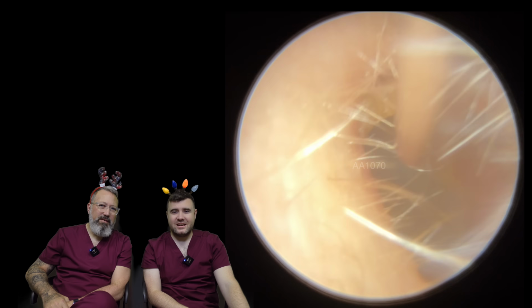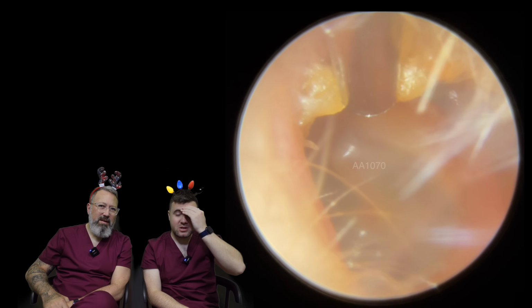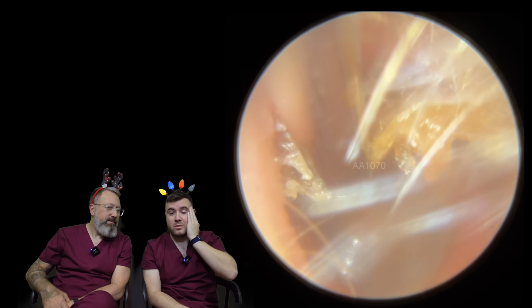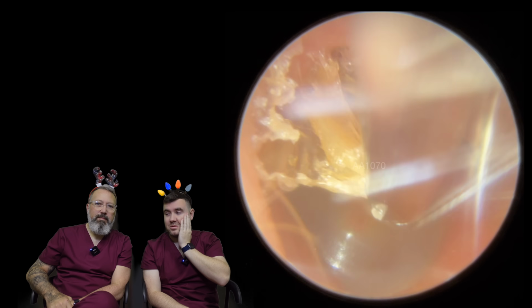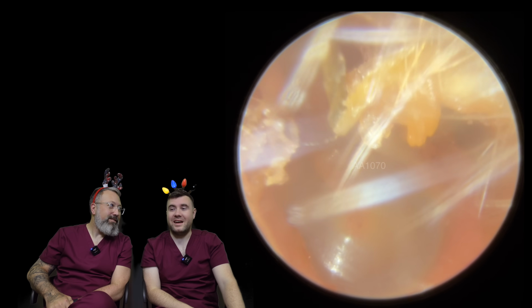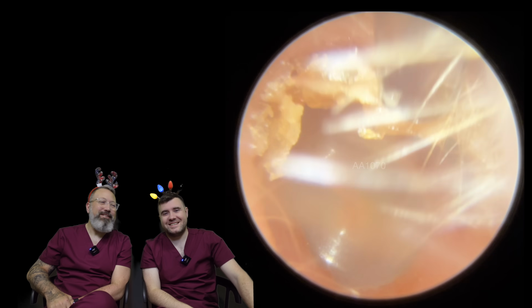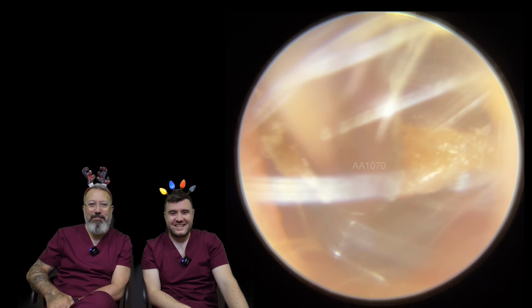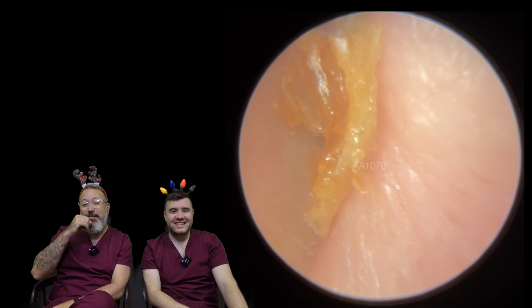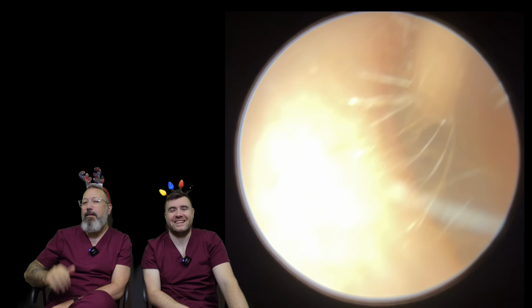Nice big chunky piece there as well that came away. I always need to remember to slow down when I'm coming out of the ear. It's a bit awkward when you've got a family member sitting on your shoulder and you pretend you're frozen. Like the Matrix kind of thing. That'll be handy if you could take the wax out like that. That'd be great, like bullet time.